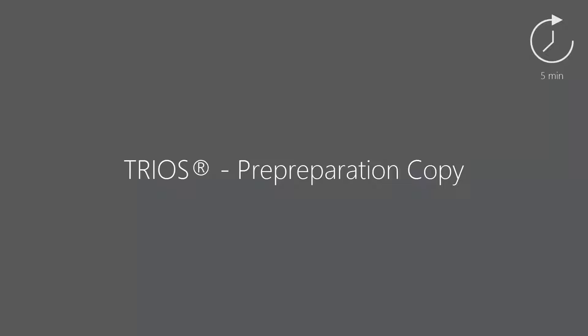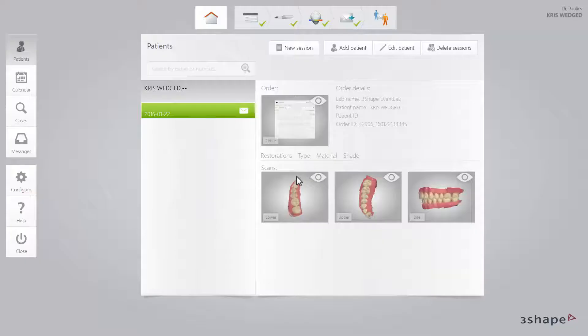In this video, you will learn how to create a pre-preparation copy. This workflow may come in handy for restoration cases where you already have a scan of the patient's unprepared tooth. Using this workflow, you will only have to scan the preparation itself, not the rest of the arch.